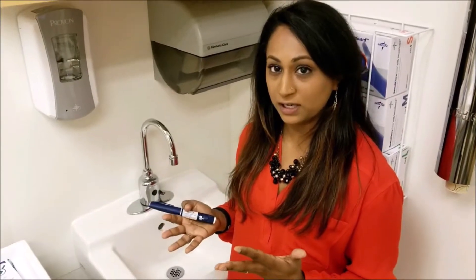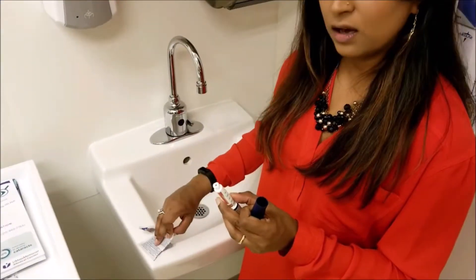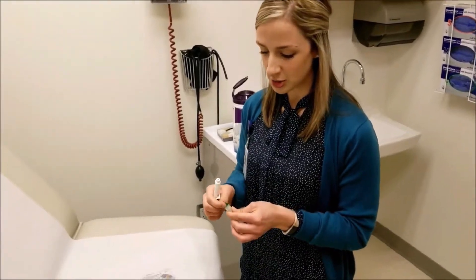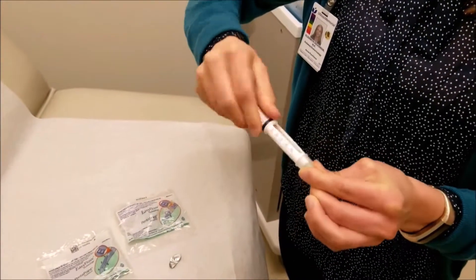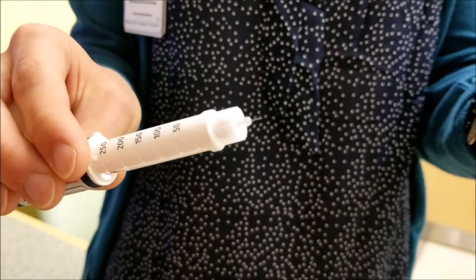Wash your hands, make sure they're clean. Remove the cap of the pen, and then use an alcohol prep pad to clean the top. Now we're going to attach the needle. You're going to pull off the paper and push it and twist it like it's a light bulb. The safety cap you can remove and discard.